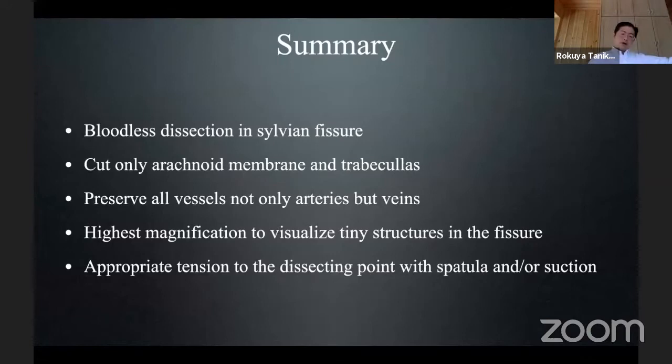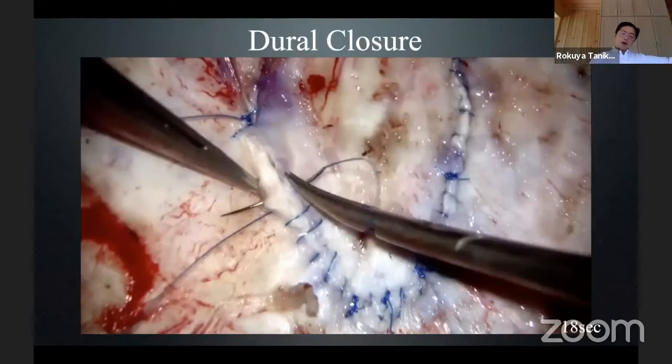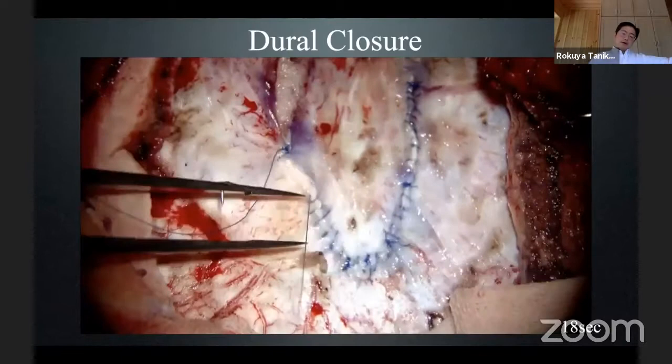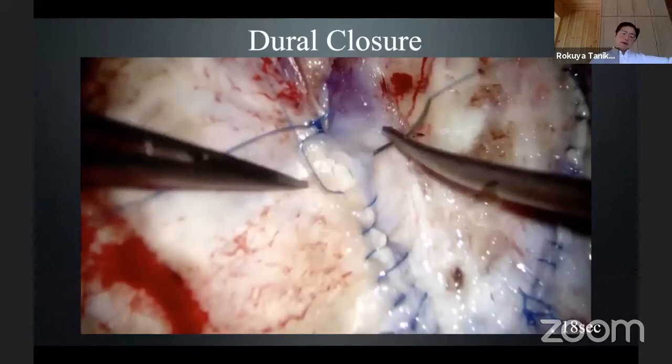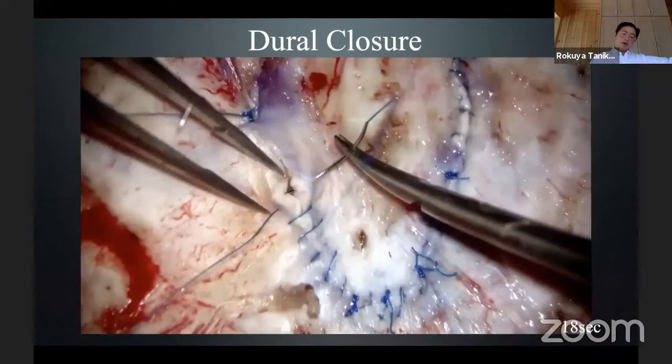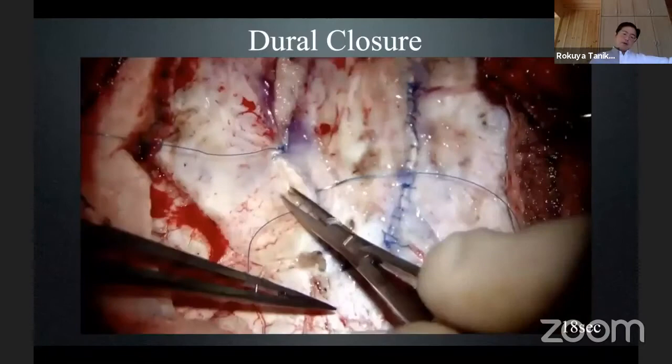You need appropriate tension to the dissecting point with the spatula and/or suction. This is an example of dural closure. I always use the microscope. After the approach and manipulation of aneurysm or bypass, after finishing my microsurgical subdural manipulation, I continuously use the microscope to close the dura.